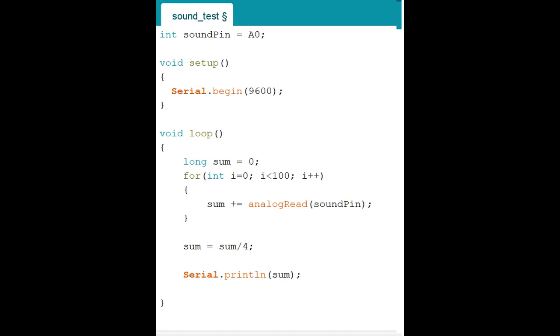For example, 1 plus 1 equals 2, right? And then you want to plus 1 again, plus 1 again, plus 1 again. When do you want to do that? When you count time, when you count how many times you did it. So you're telling the computer, hey, how many times did I press letter A? For example, how many times people visit my website. They all use a loop. Like counting time, 1 second, 2 second, 3 second, things like that. So this is a very powerful tool, as you can see.